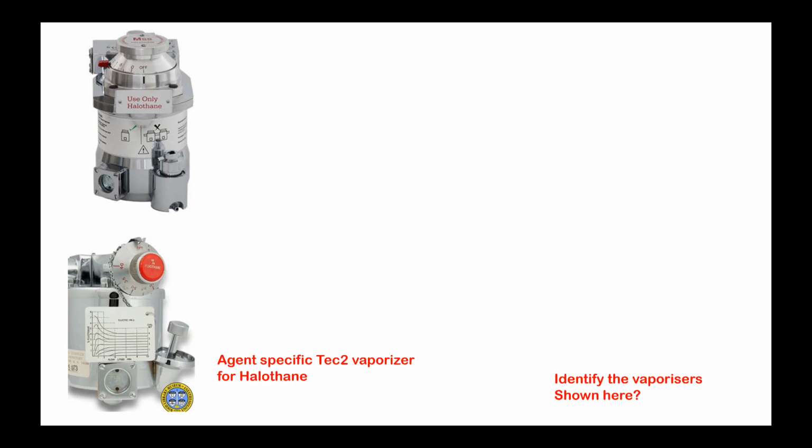Whether the liquid anesthetic agent is full or not, the level of the anesthetic agent when you fill. And what is the name for this? This is called the sighting glass. You look through this to see the level of the liquid. So this is called the sighting glass.